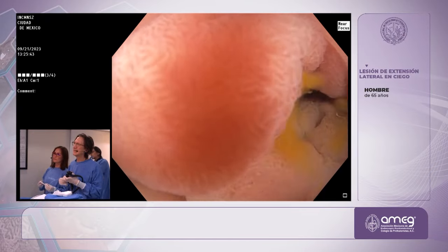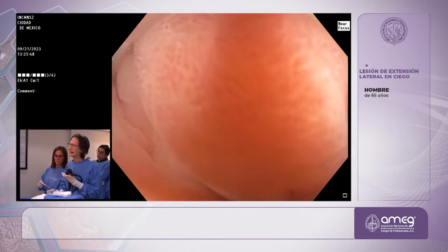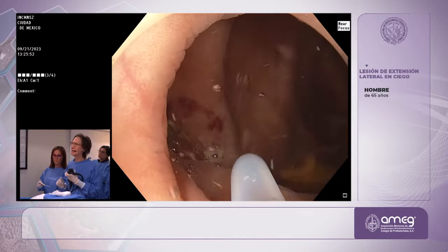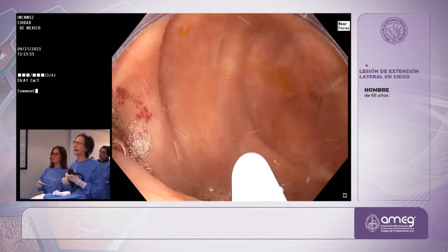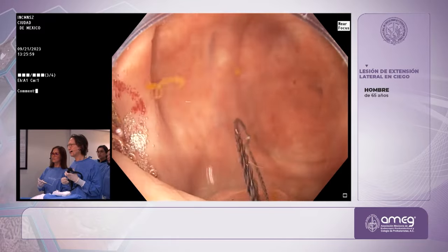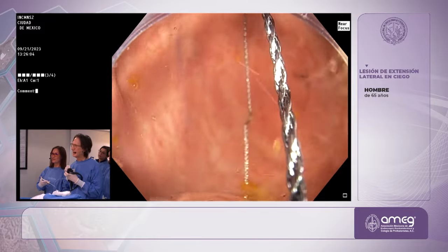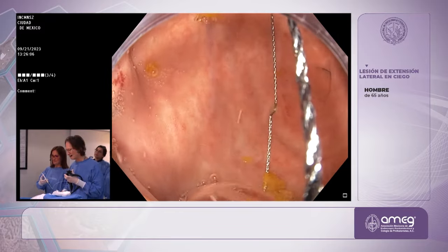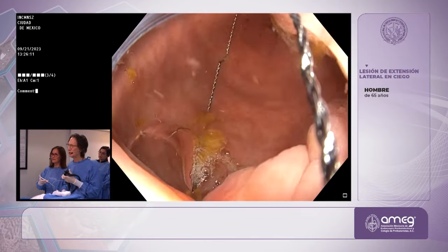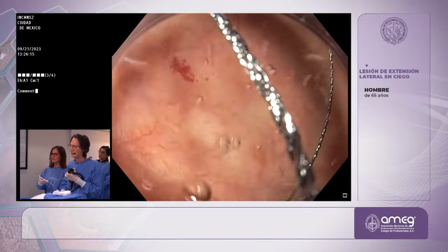All right, so in a moment you're going to see the snare. And let's sort of see how this looks. It's a 25. And maybe with some finesse, I might be able to somehow get it to float in. Open the snare, please. Thank you, Angelica. Open it all the way, please. All right, so let's have it opened all the way. I'll take off the near focus. These snares are not really rotatable. So what I'm going to do is just sort of pull back. I've still got an air bubble here. So I'll suck that one out now.